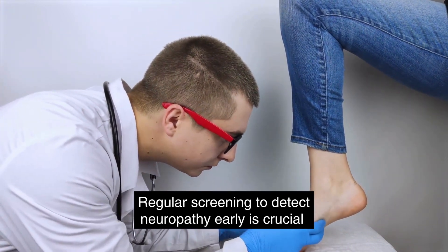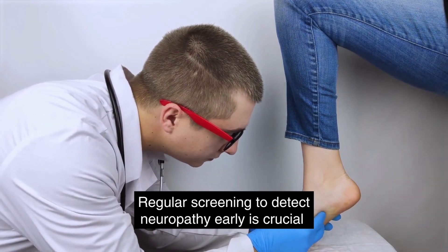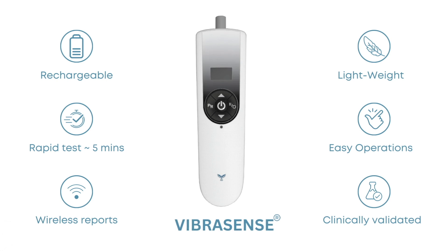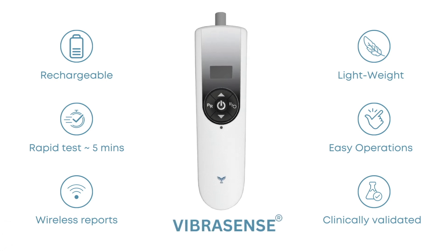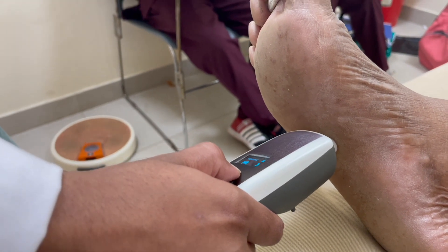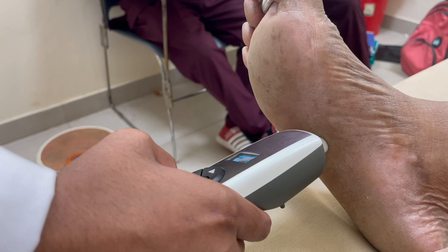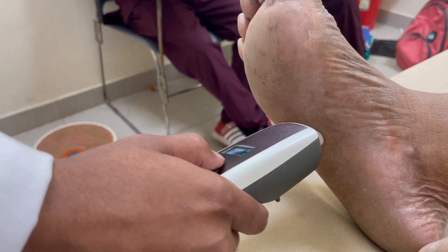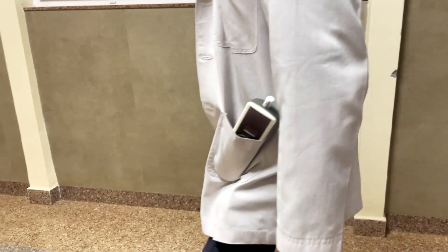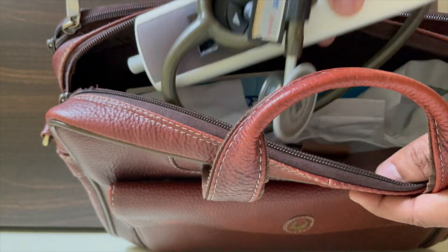Early detection of neuropathy is of utmost importance to prevent complications like foot ulcers and amputations. Introducing VíbraSense — your ultimate portable and smart peripheral neuropathy screening device. This innovative technology quantifies vibration perception threshold, revolutionizing the way doctors perform neuropathy screenings. What sets VíbraSense apart is its remarkable portability, fitting snugly in a doctor's coat pocket.